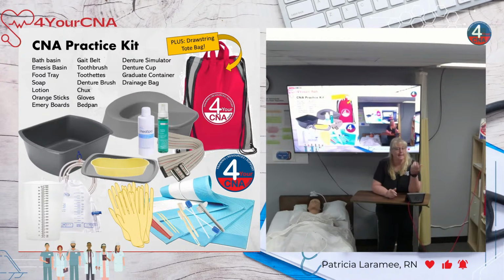And the reason is, remember that the test is nothing more than an audition to say I'm ready to work. That's all the test is. So when you go into the test, if I tell you, hey, go empty that drainage bag, I'm not going to tell you you need a set of gloves, a barrier, a graduate container, your documentation sheet, and a pen. I'm going to expect that you know what you need to do that job. So I'm going to just say, go empty the drainage bag.